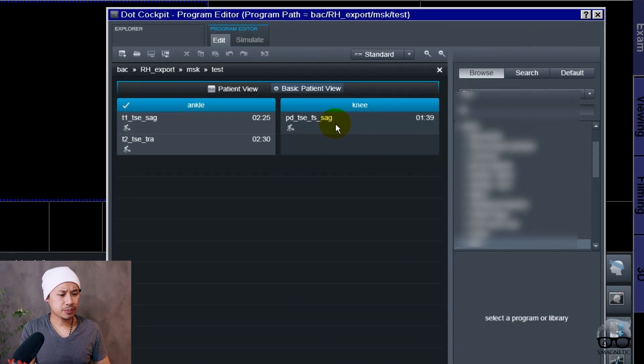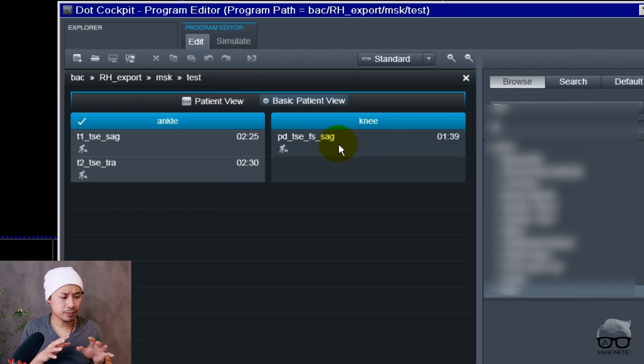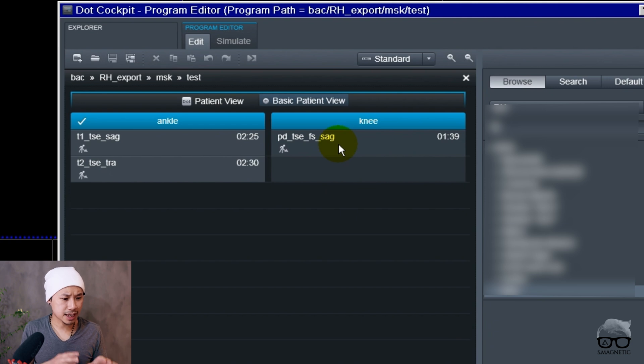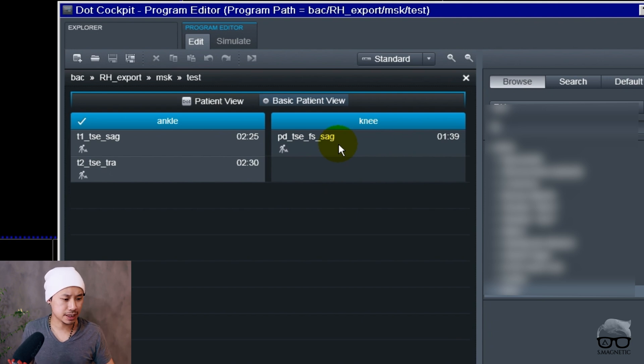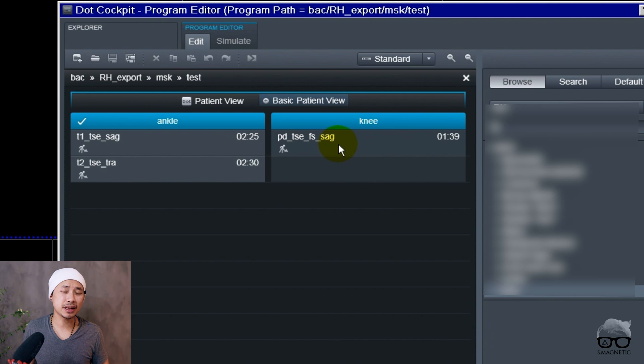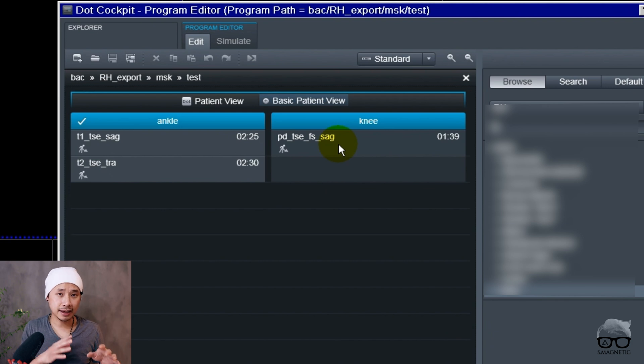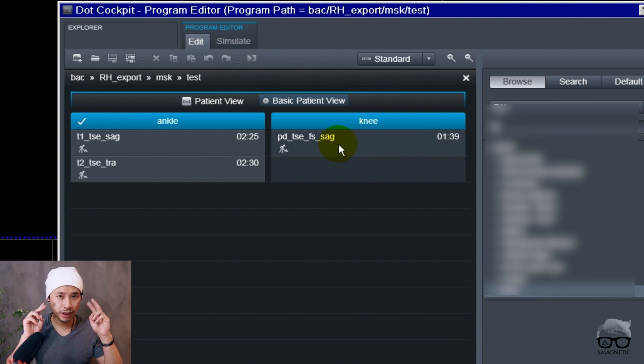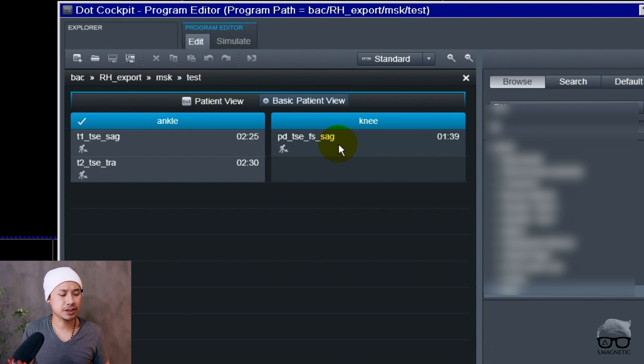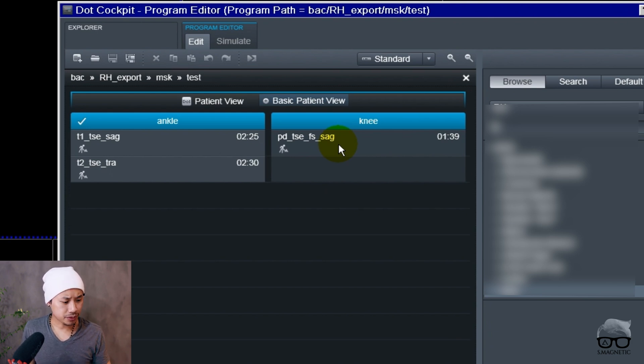I've put a protocol right here. One says ankle and the other one is knee, as you can see. Inside the scanner currently I have the ankle coil right, so we're gonna do a foot ankle examination. I'm just gonna put up a protocol like this for you here.